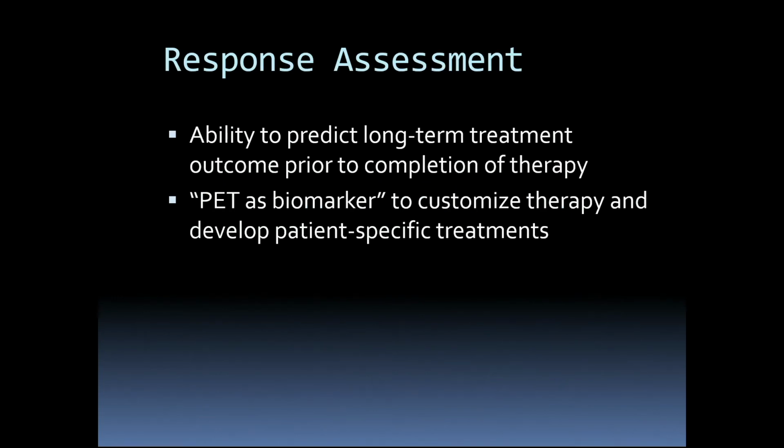So what is response assessment? Well, response assessment is the ability to predict long-term treatment outcome. We don't just want to know what's happening to the patient today as we see them in the clinic. We want to use that information to hopefully predict what's going to happen to them down the road. And the shorter that interval of time can be, really the more ideal for the patient.